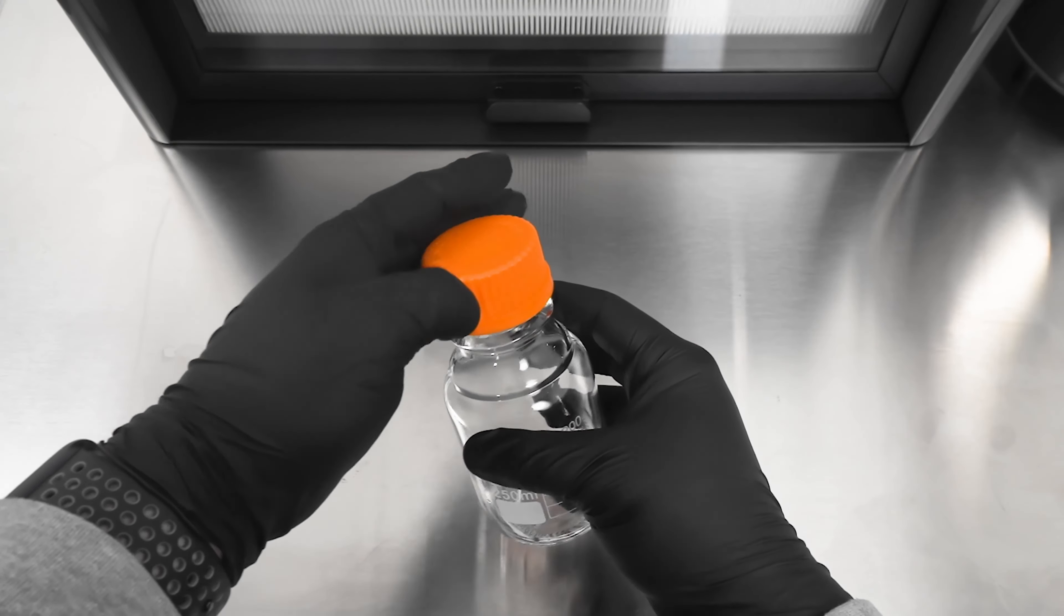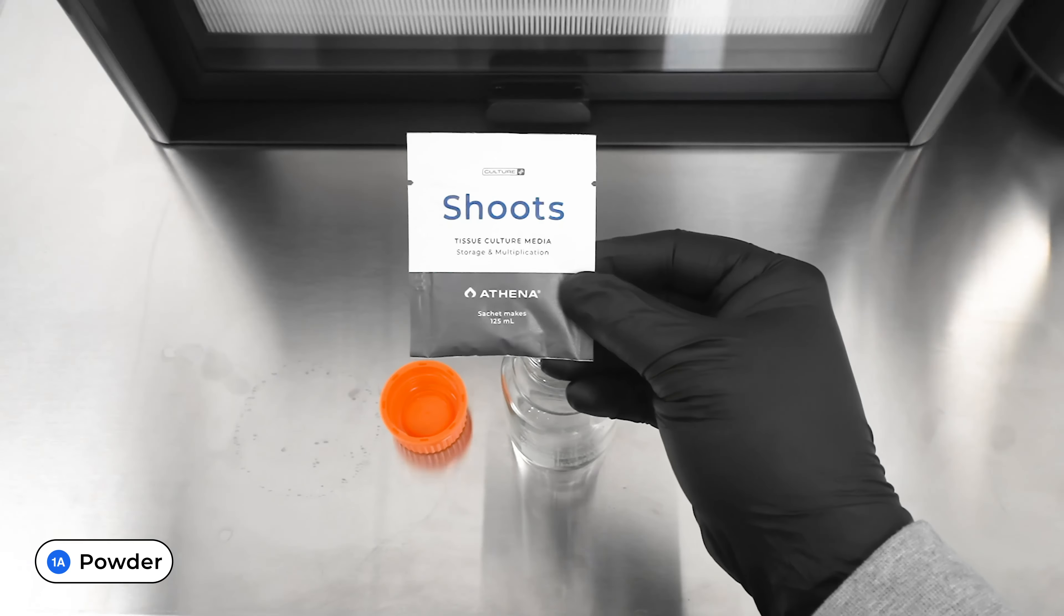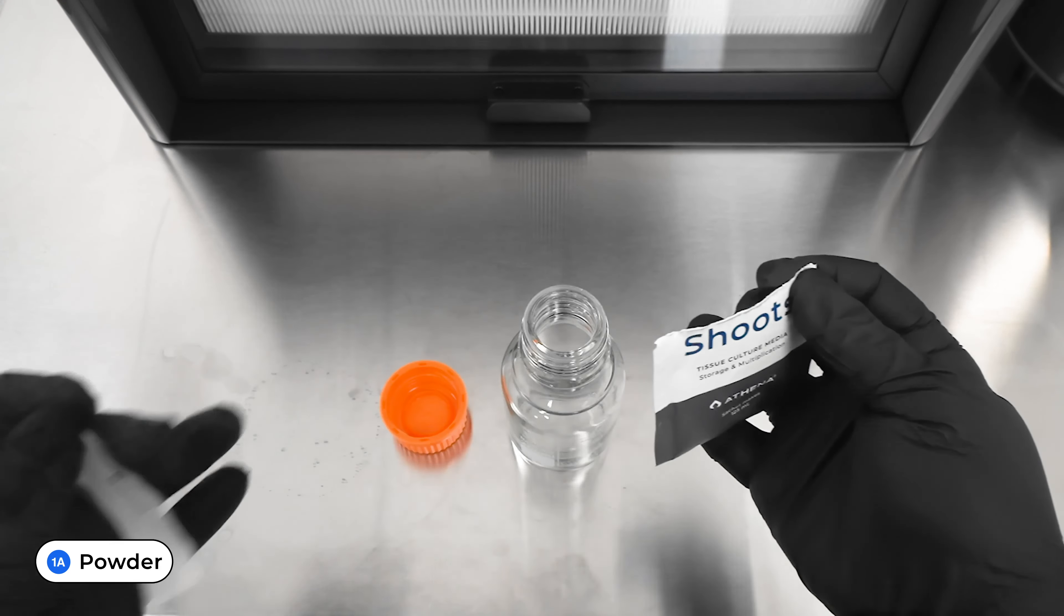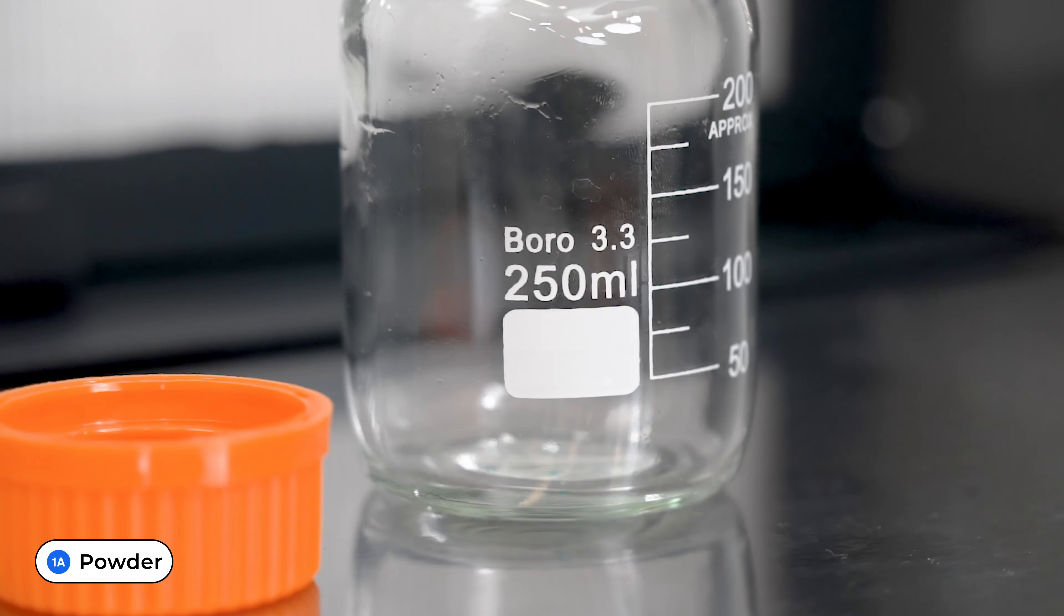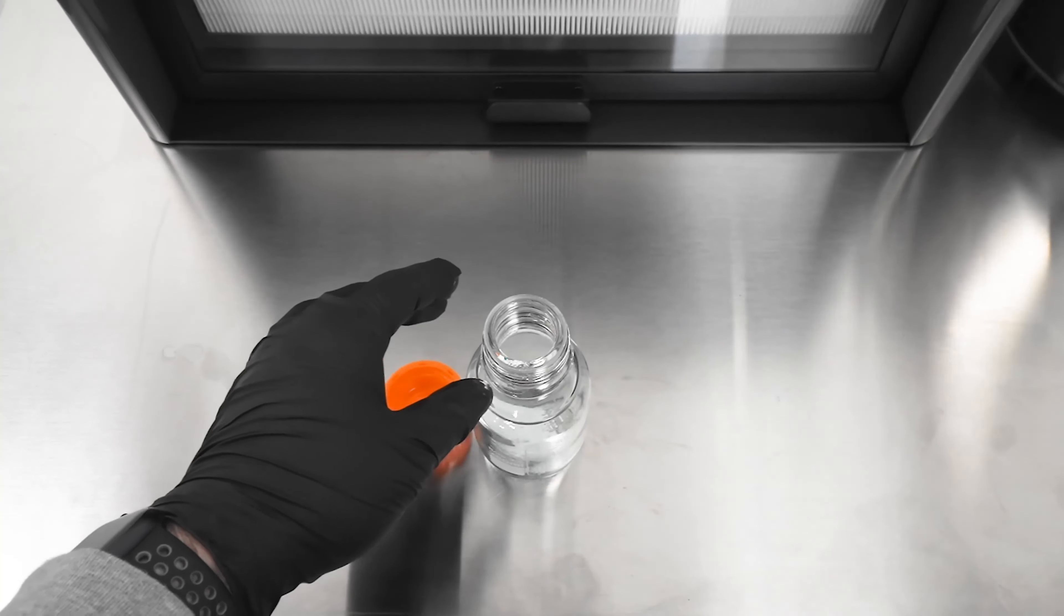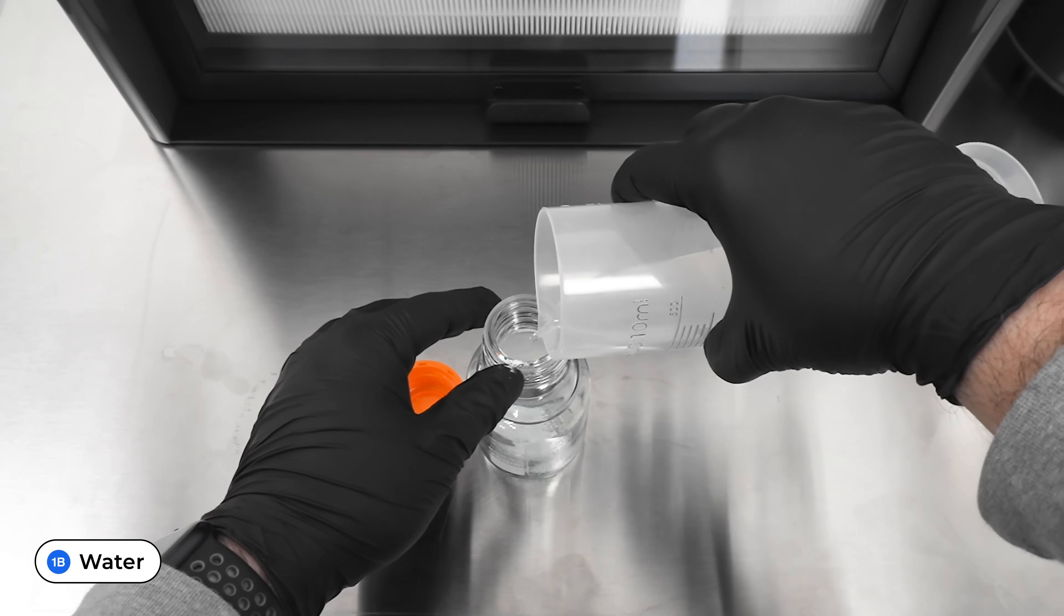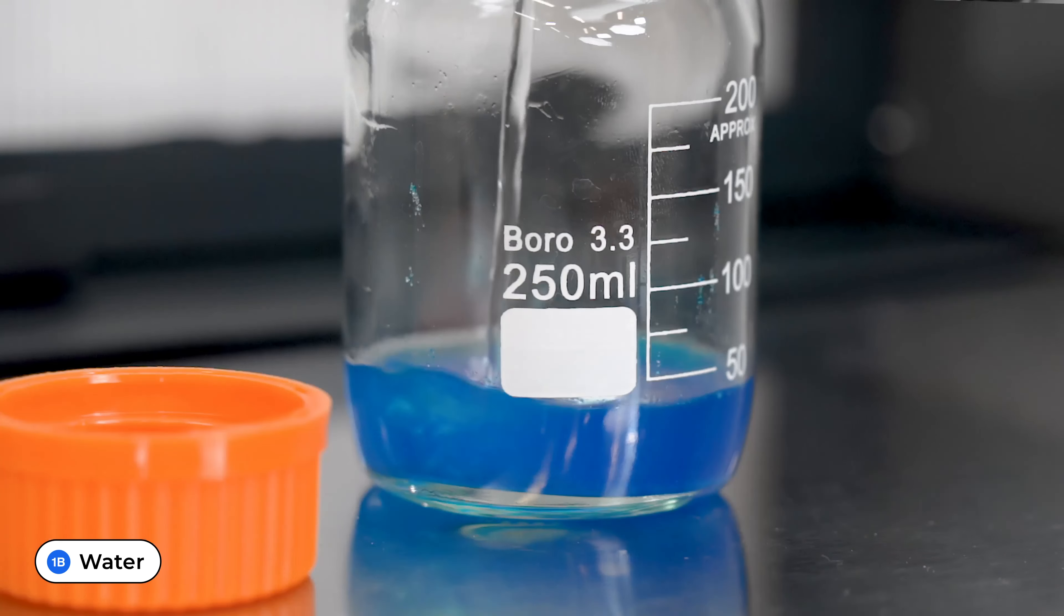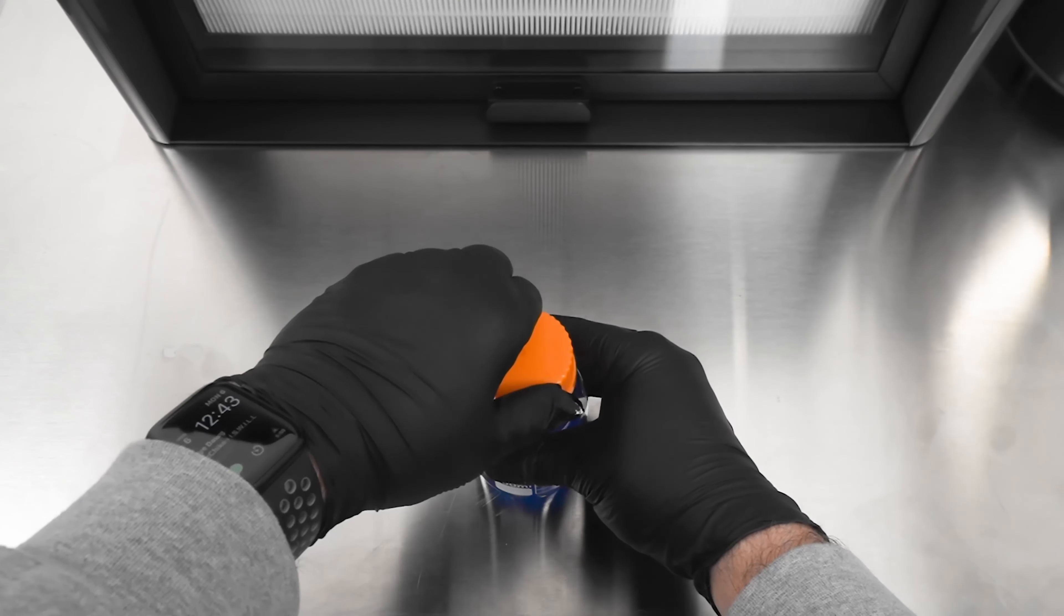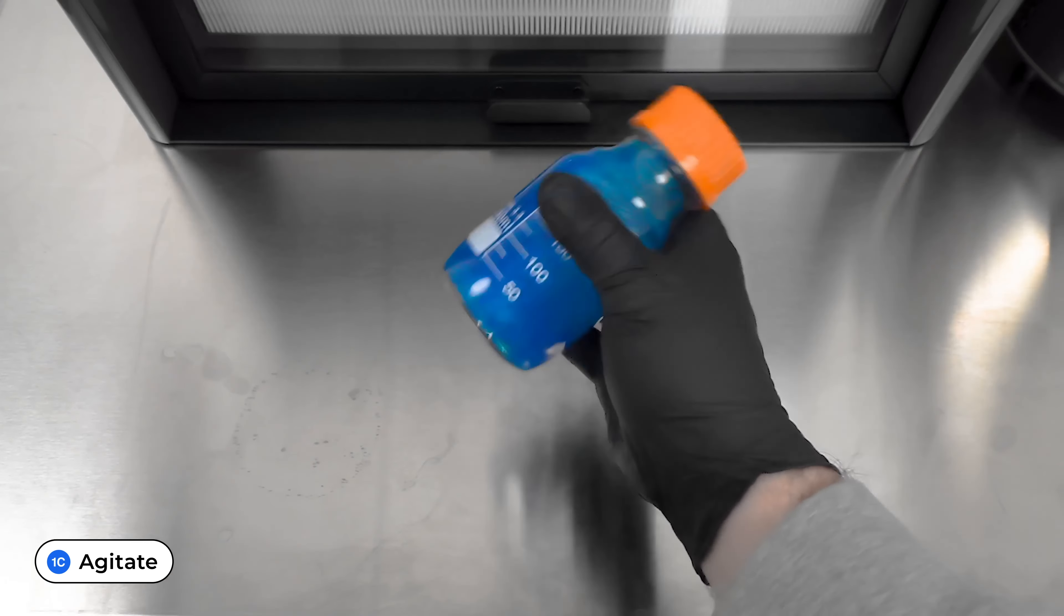Step 1, Media Prep. Pour one pack of 125 ml Shoots or Roots media powder into the 250 ml media vessel. Fill the media vessel with filtered water up to the 125 ml mark. Close the media vessel and agitate the solution until it is dissolved.